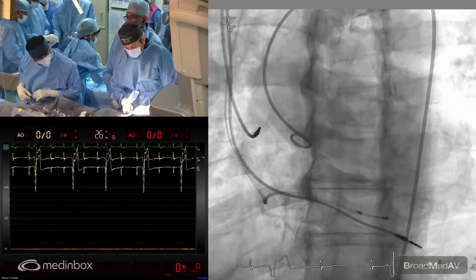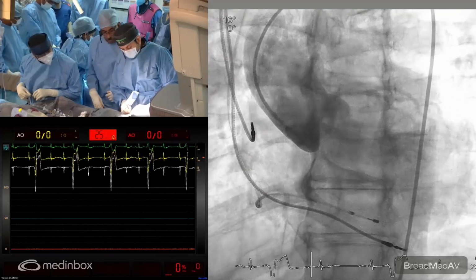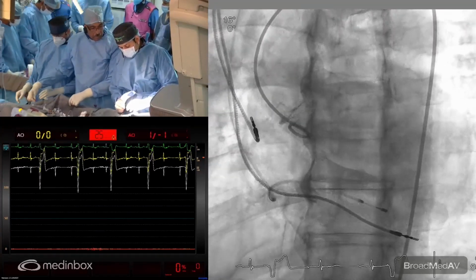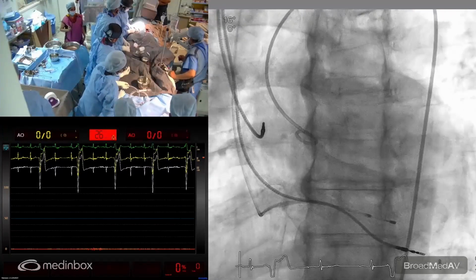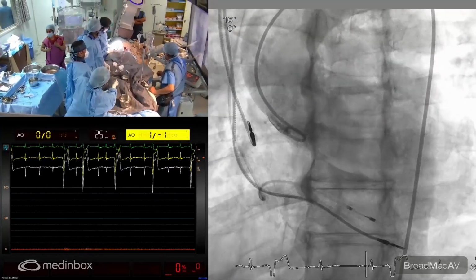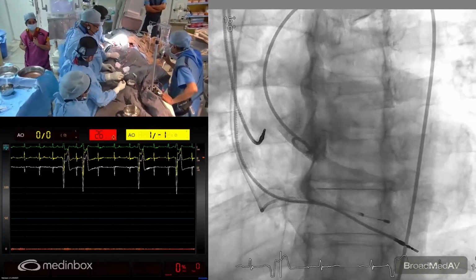So with that, we are going to crimp one of the commissures at 2 o'clock, and post procedure at 1 month CT, we are going to check whether it is exactly aligning as per our hypothesis or not. There are published papers in the Align TAVI trial, which show that for the balloon expandable valve the concept is not great, because it not only depends upon the anteroposterior transition from exterior to interior, but also depends upon the aortic angle.